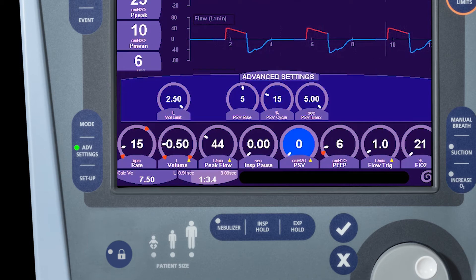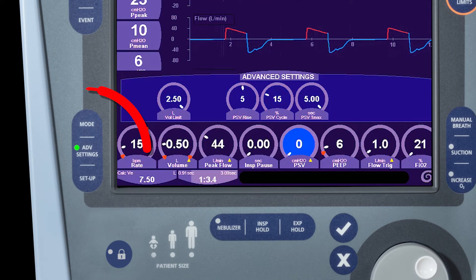To close the advanced settings window, simply press the advanced settings button on the front of the ventilator.